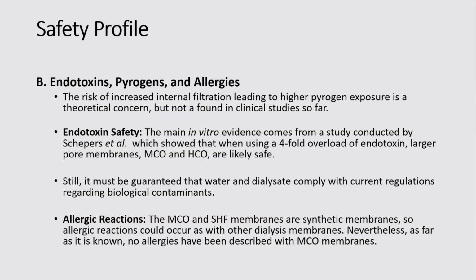They found there was no significant increase in the endotoxin levels in that experiment. So it was concluded that they are safe with respect to the risk of transferring endotoxin across the membrane. But we have to guarantee that the dialysate water which is employed follows the current regulatory guidelines.